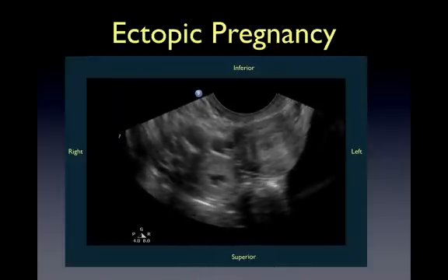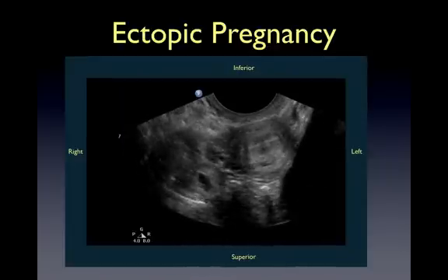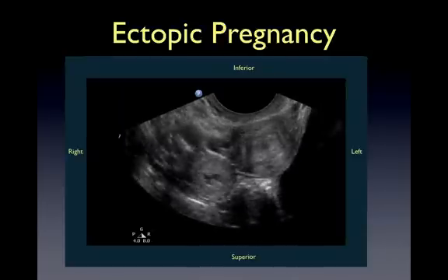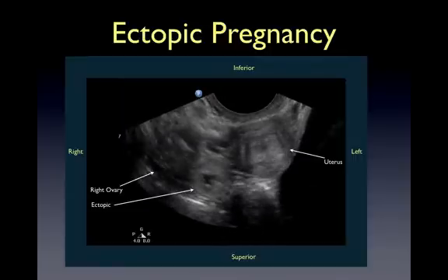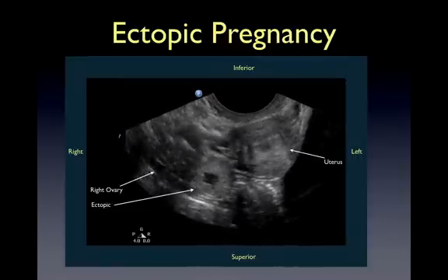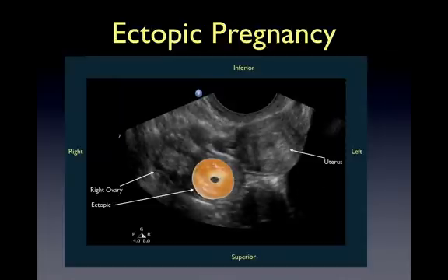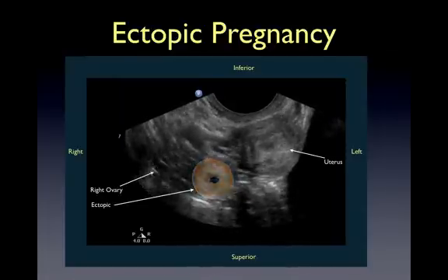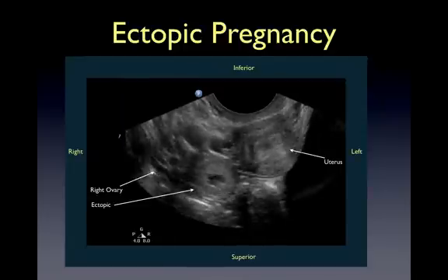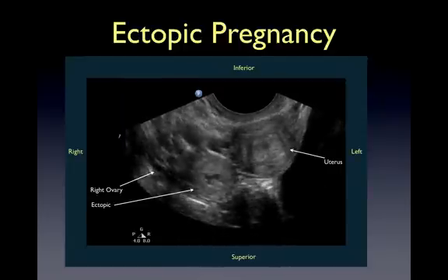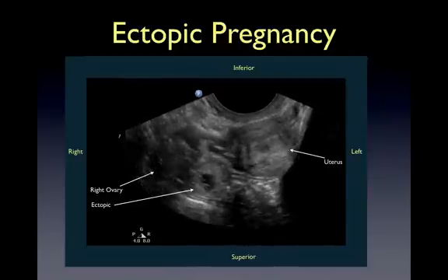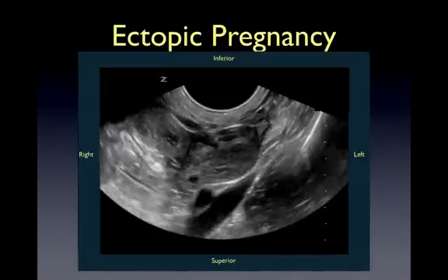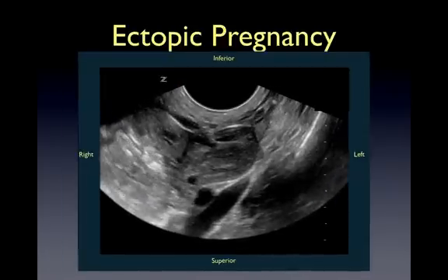A major advantage of transvaginal ultrasound is the earlier gestational age at which the diagnosis of an ectopic can be made. An intact and well-defined tubal ring, commonly referred to as the bagel sign, is seen medial to the right ovary in this clip. While not evident here, you may see a yolk sac, fetal pole, and heartbeat within the tubal ring. In a different patient, this clip depicts a tubal ring medial to the left ovary.